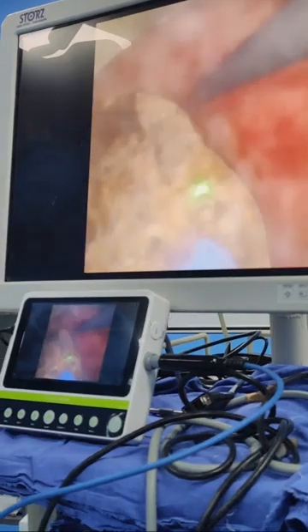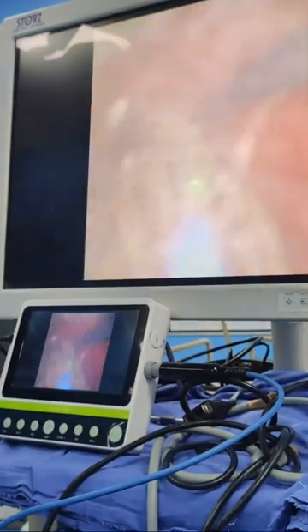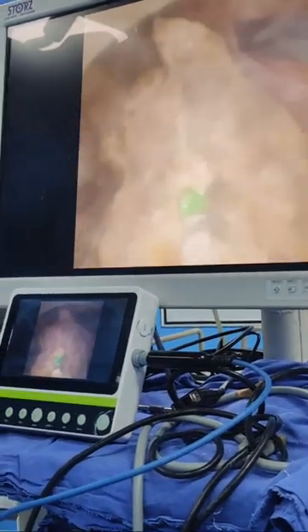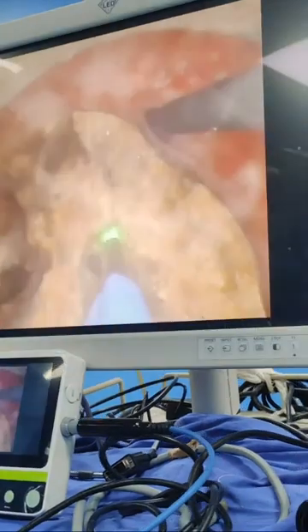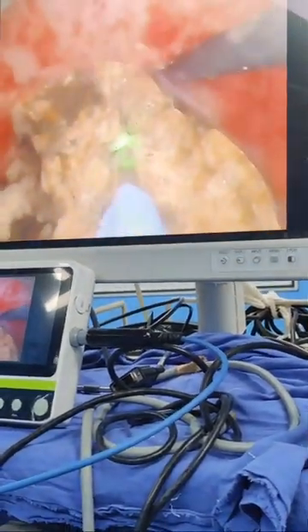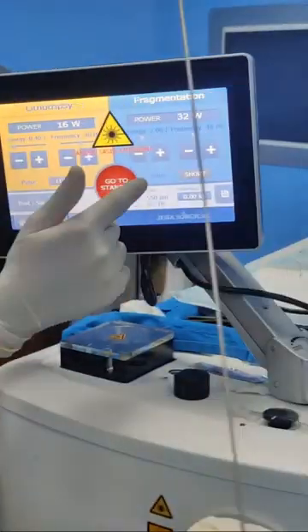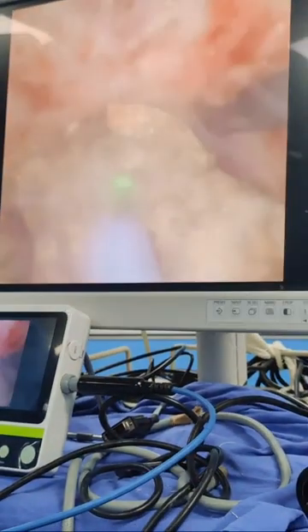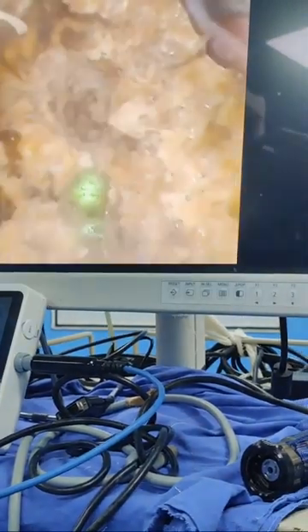Beautifully, we are removing the stone with a 16.5 French nephroscope and a guide wire, and a 21 French sheath with a laser. And vision is beautiful, the fragmentation is very good speed. We are using 2 joule energy and 16 frequency, so it's a total 32 watt energy. And we are gradually breaking up the stone. There is no rise in the pressure, the vision is clear.